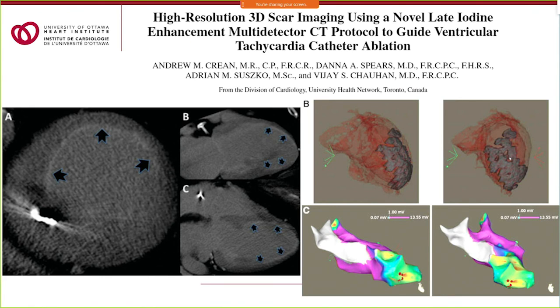This is a fourth case we did when I was still in Toronto, and this is actually an example where VJ took the data, and we created a 3D cast with the scar mapped on, and then managed to merge it and import it into Carto and use it as part of the procedure. And I don't understand these lovely coloured maps, but I'm told that the scar area here correlates pretty well with the electroanatomic findings. So that was my filling in between the two slices of cake.